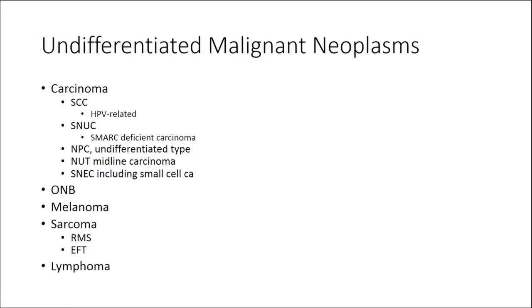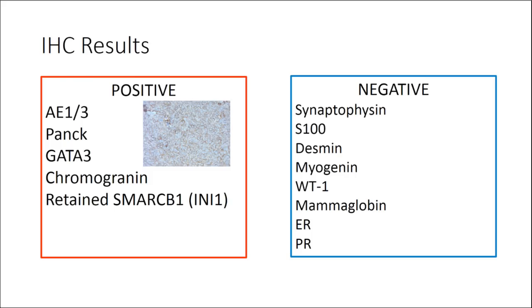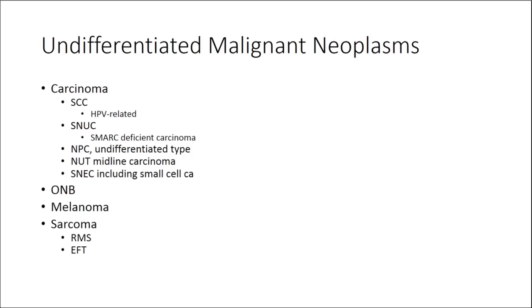I think our differential in this, if we go through what we had been talking about before, still has a variety of different things in it. I think we take away lymphoma, and that's probably pretty much all we can take away at this point because we haven't established everything else. It still could be some of these other types of lesions.